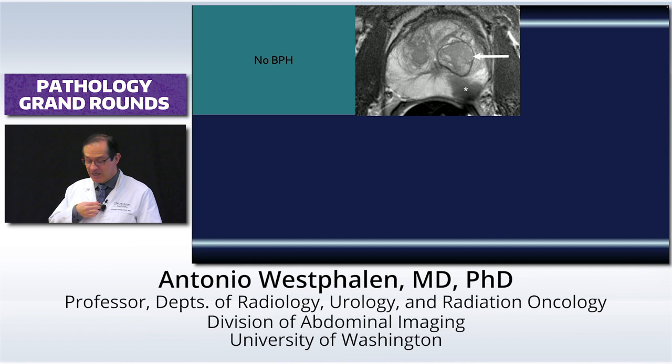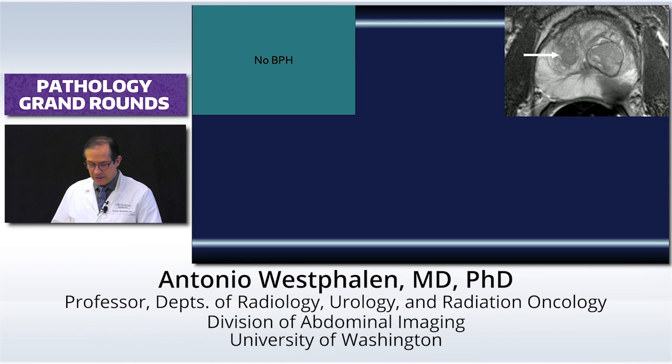And then you have the BPH nodule that they call, this is the BPH nodule. It has a little rim around it, and you have a really well-defined nodule. And that's fine, this is all good. And then you have these guys that are a little bit less defined. They're still stromal tissue, round, but not as round as the other one. So this is one of the variants.